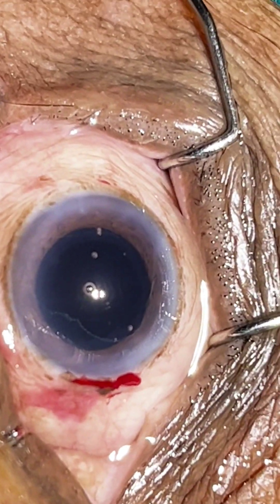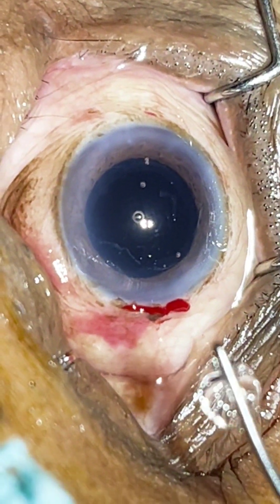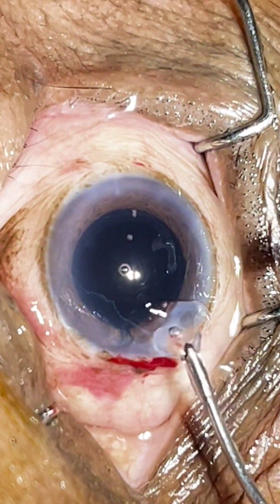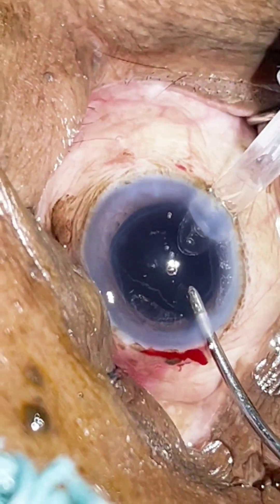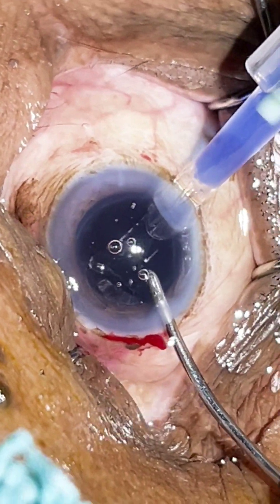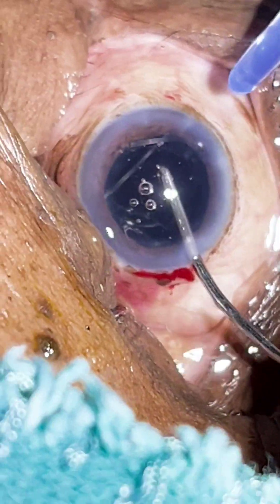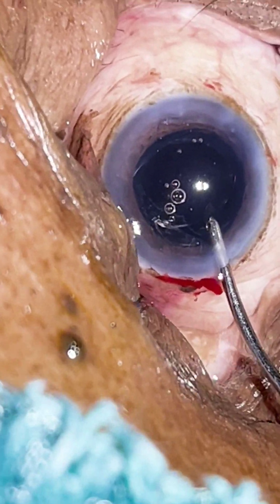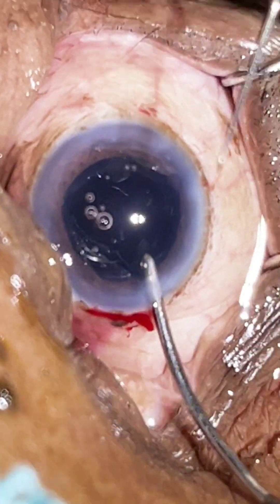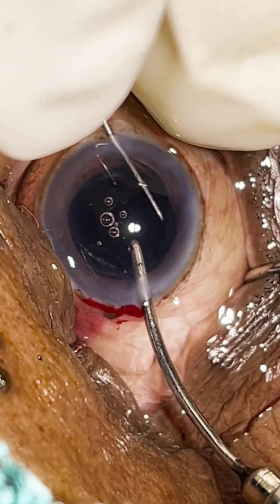The cortex removal is over. Now we will go for IOL implantation.